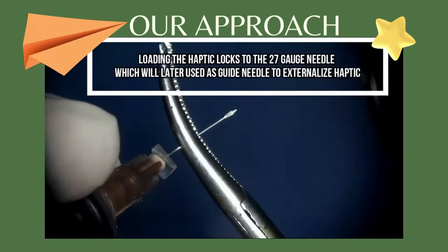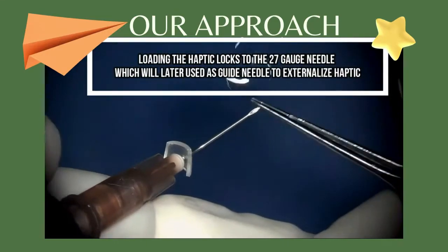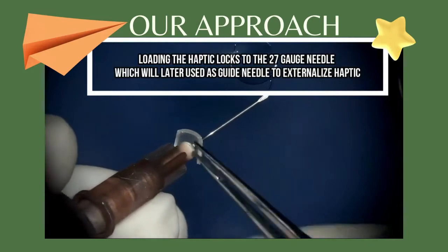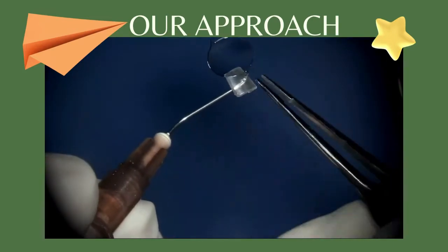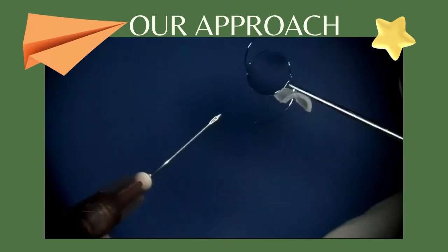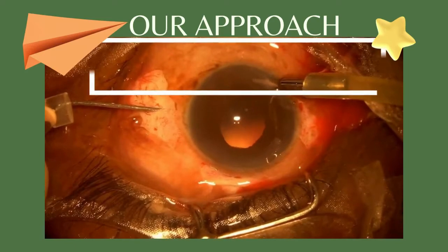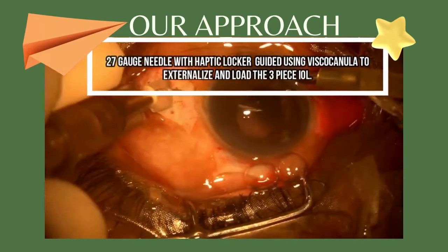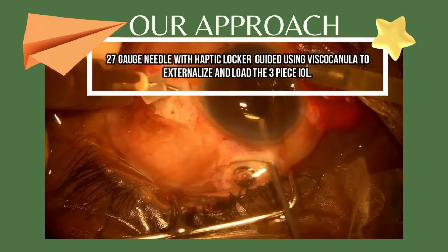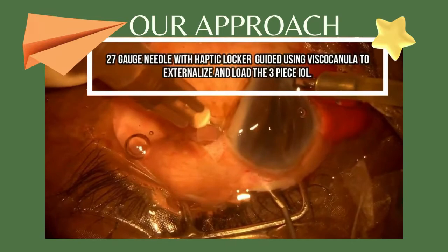The 27 gauge needle is again bent at an angle of 50 to 60 degrees near its hub. The cut piece can be transferred onto the haptic of the lens and hence acts as a haptic lock to prevent it from slipping into the vitreous cavity during the surgery. Now this angled 27 gauge needle with the haptic lock is introduced into the vitreous cavity just distal to the scleral pocket created. A simple visco cannula is used to guide the tip of the needle to the external environment.